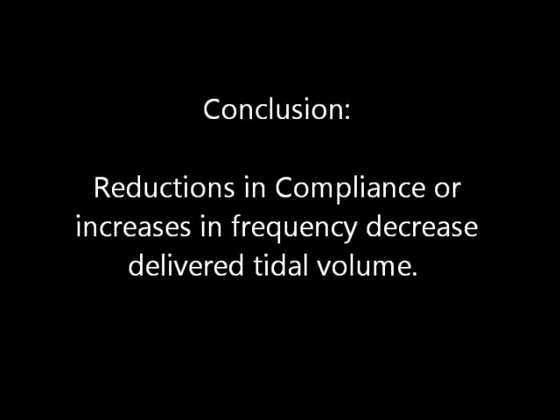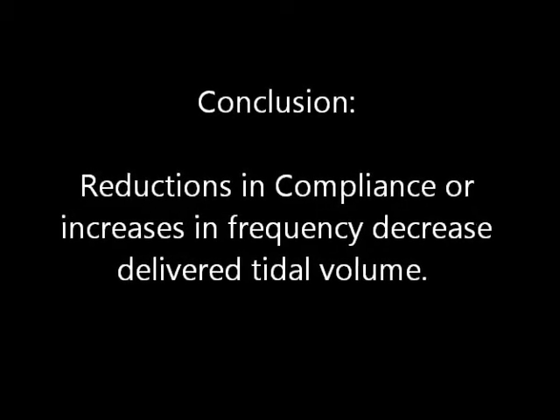Conclusion: reductions in compliance or increases in frequency decrease the delivered tidal volume.